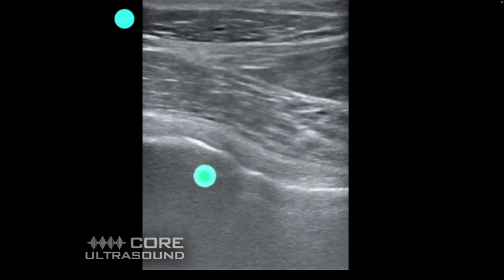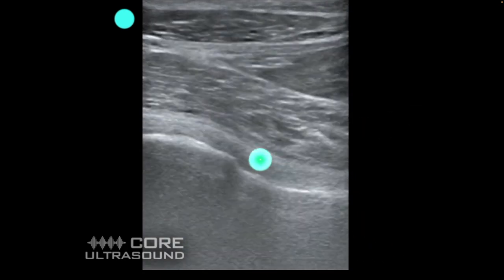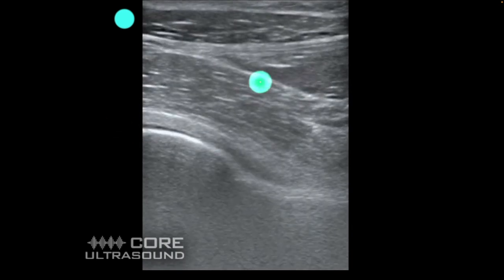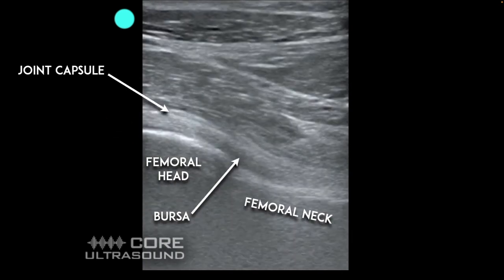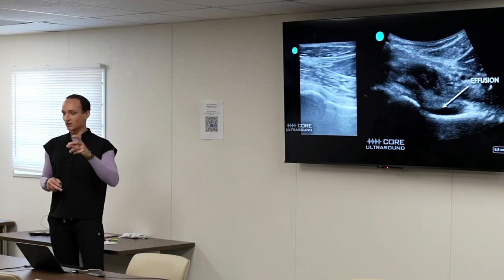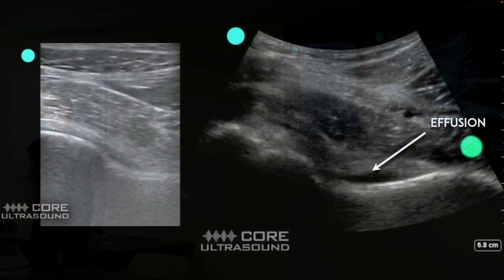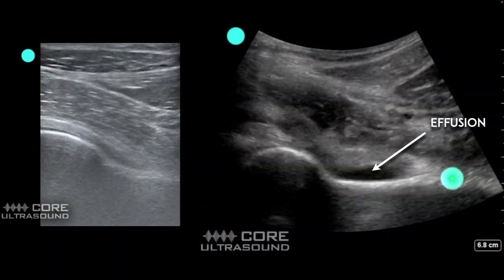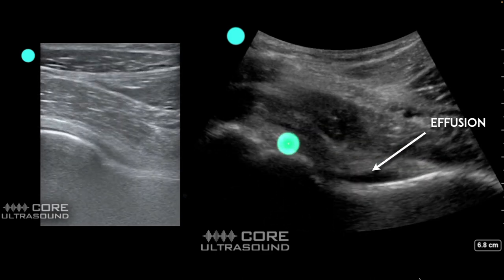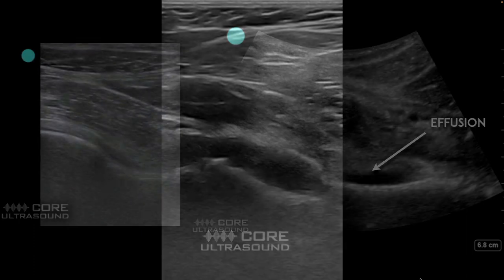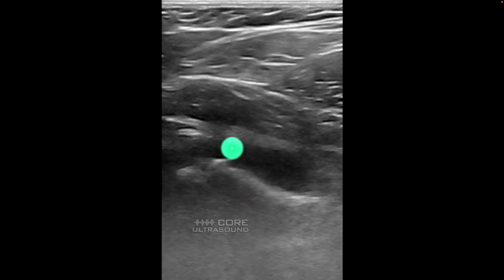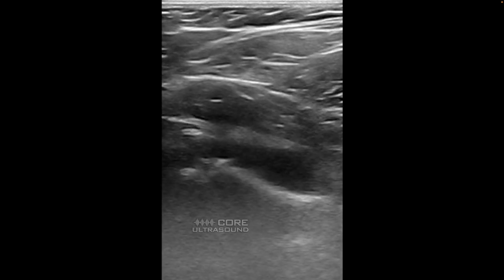Here's the anatomy: femoral head, femoral neck, and the entire capsule overlying it. Most of the time you're more likely to see the effusion over the neck rather than the head. Here's an abnormal effusion — notice it's mostly over the neck, which is why it's so important to visualize the neck since the capsule extends all the way down. This is also a pediatric patient example — you can see the growth plate, and the effusion is more toward the head. You need to evaluate both head and neck.